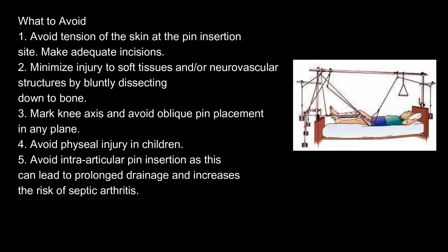What to avoid. 1. Avoid tension of the skin at the pin insertion site. Make adequate incisions. 2. Minimize injury to soft tissues and/or neurovascular structures by bluntly dissecting down to bone. 3. Mark knee axis and avoid oblique pin placement in any plane. 4. Avoid physeal injury in children. 5. Avoid intra-articular pin insertion as this can lead to prolonged drainage and increases the risk of septic arthritis.